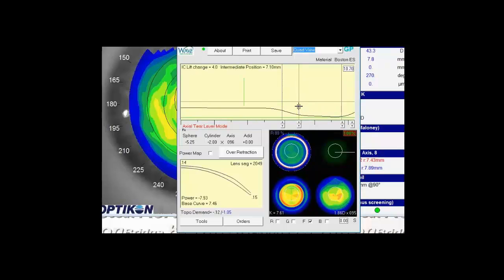So there are three control points we have here. If we look at the red control point, that's going to be again our optic zone. The blue is going to control our intermediate curves and the pink controls the edge. The black is the bevel lifts, that's the final bevel cut of the contact lens.